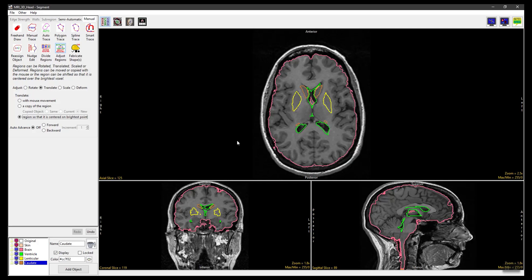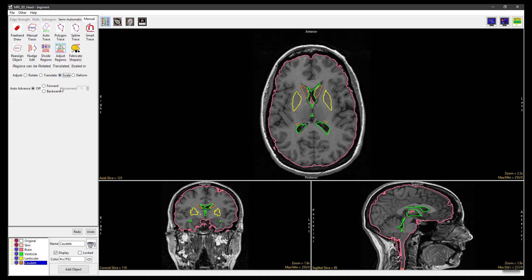Now click Undo and set the Adjust method to Scale. Click in an object and move the mouse to increase the scale of the selected object. Moving the mouse up and down adjusts the scale in the vertical direction; moving left and right adjusts the scale in the horizontal direction. Moving the mouse diagonally adjusts the scale while preserving the shape. Release the button to commit the scale manipulation to the object.